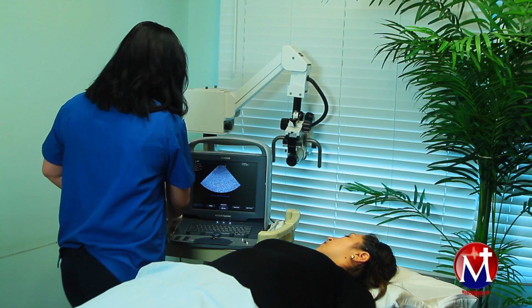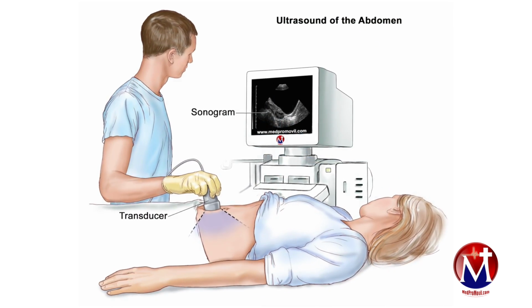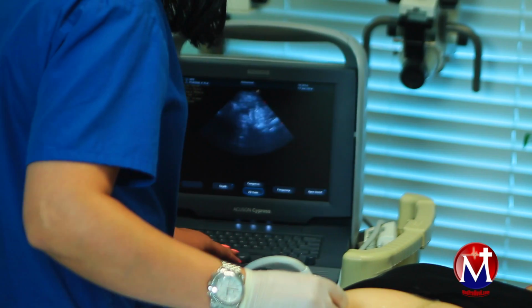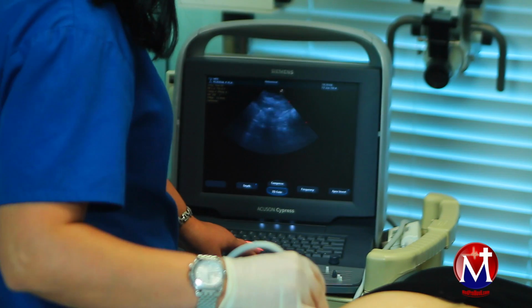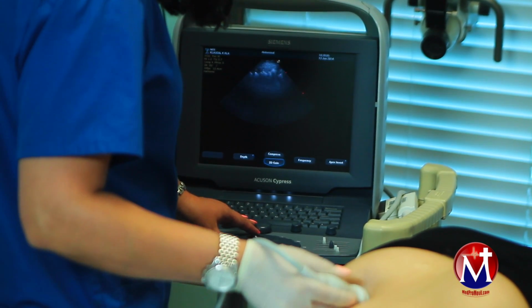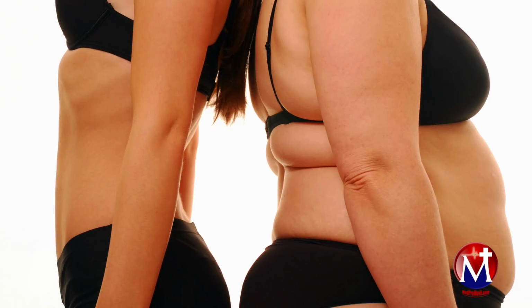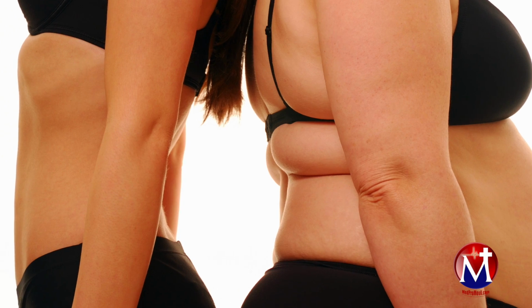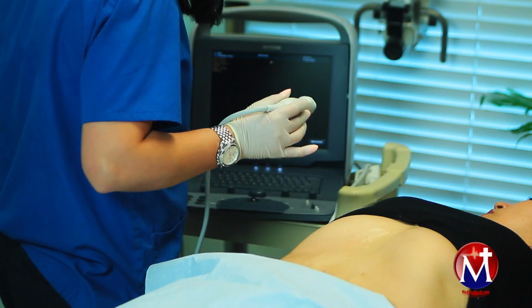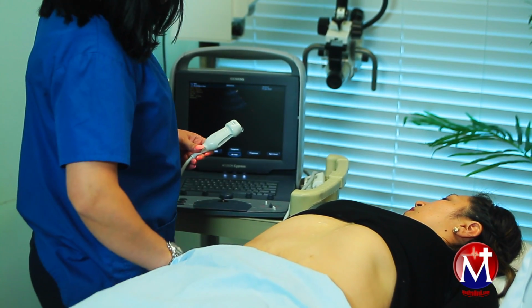Abdominal ultrasound substantially reduced the number of intended referrals to a medical specialist, and more patients could then be reassured by their general practitioner. There's no discomfort, risk, or radiation exposure with ultrasound. There are some conditions, though, that could interfere with the results of the abdomen ultrasound exam. These include severe obesity, intestinal gas, and barium that's left in the intestines from a previous GI series that may have been performed recently prior to the ultrasound exam.